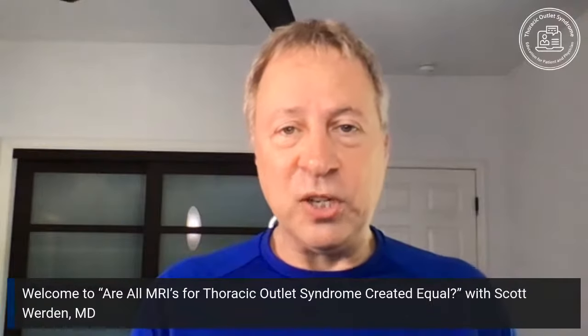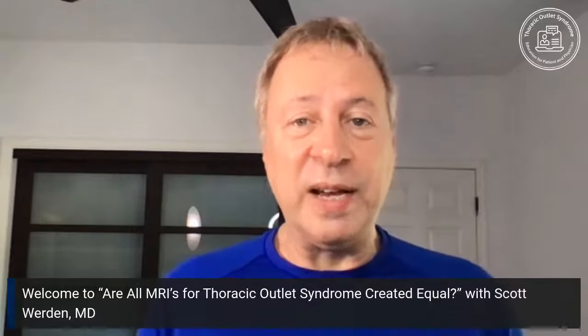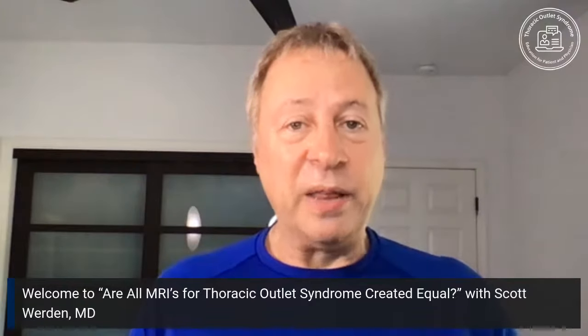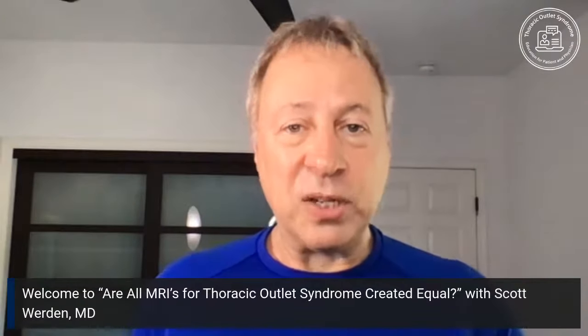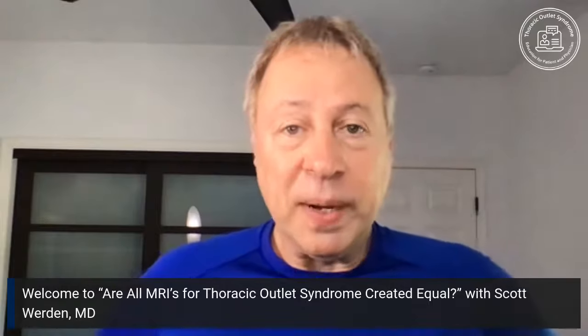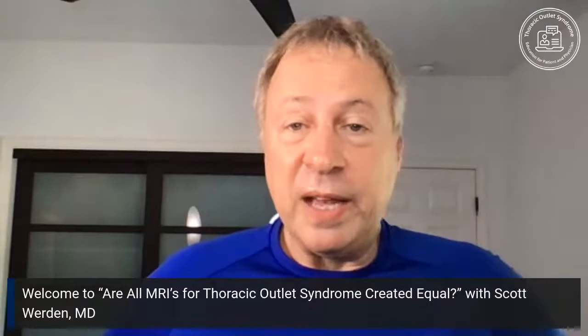Well, that comes about for a few reasons. One is radiologists don't image this area too often. Most radiologists I know kind of shake their heads and want to get through it as quickly as possible. It is a complex area, and the more I've studied it, the more I've realized how complex and variable it is. In a typical normal person, it's complex, but there's all these known anatomic variations that we have to look out for. And it changes depending on the patient's arm position and neck position. It's complex. So for radiologists who don't put a lot of time into learning it, and it takes a lot of time, they're just looking for something big. They're looking for some abnormality like a mass or some rupture of a part of the brachial plexus.